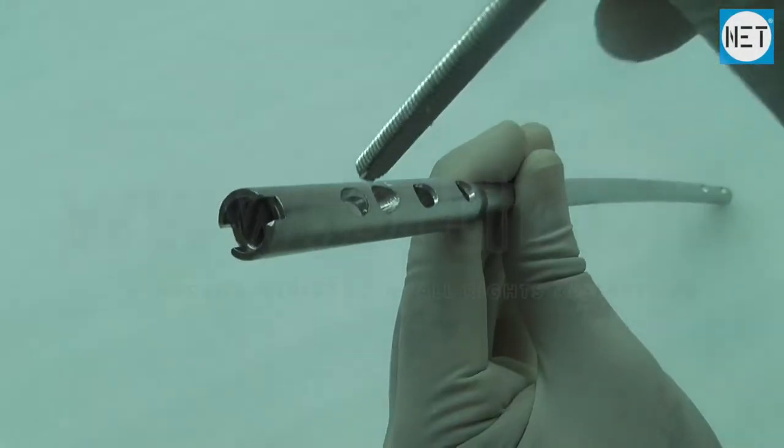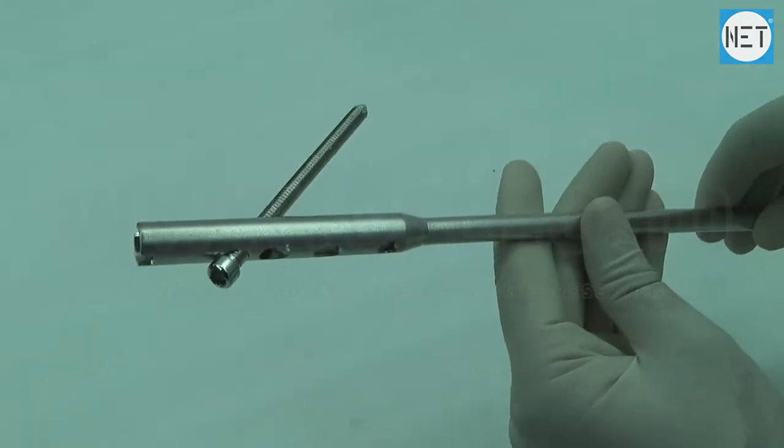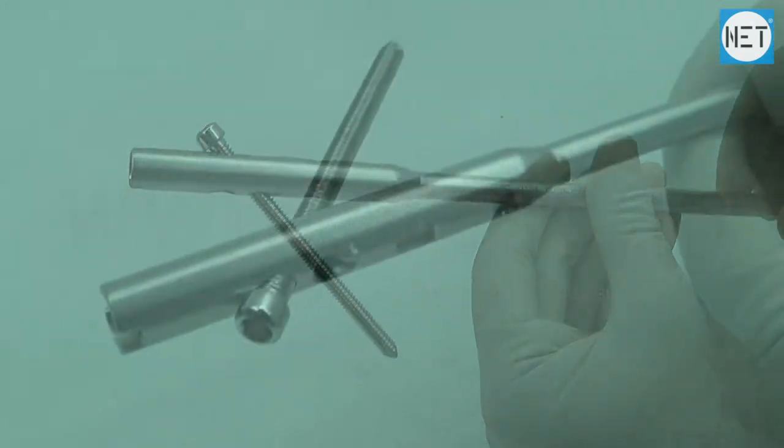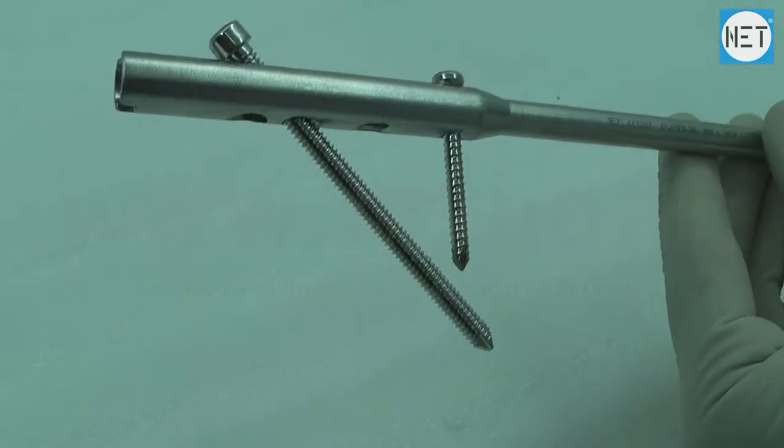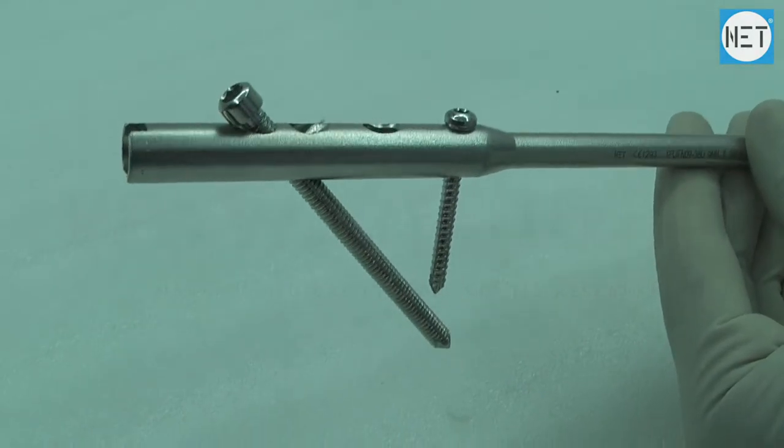The first proximal hole from the top allows 6mm locking bolt and is directed towards the lesser trochanter. The third hole from the top is a dynamic hole and supports 4.5mm locking bolt. The fourth hole from the top is static and supports 4.5mm locking bolt.